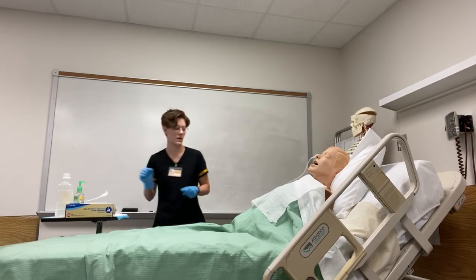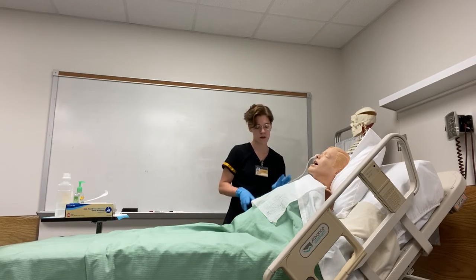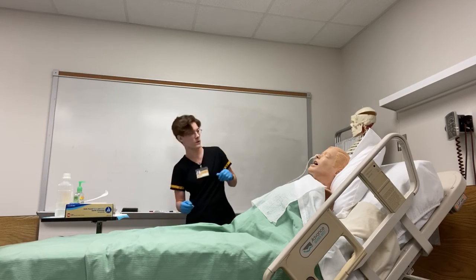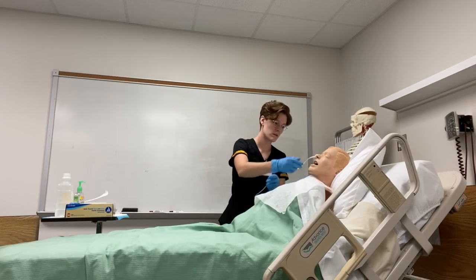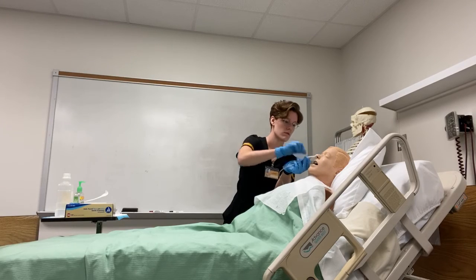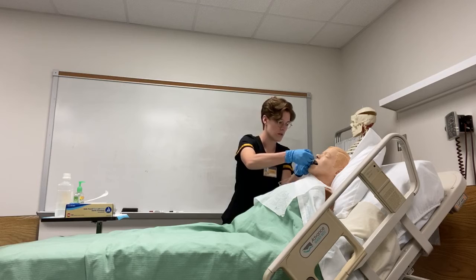So first thing, I'm just going to check with my patient, and can you please state your name and date of birth for me? Amanda Deer, 4799. All right, so the name and date of birth matches with my EMR. My order matches to discontinue the tube. So now I'm going to take the tube out of the patient. So you might feel a little bit of pressure with this, but it should be pretty easy and painless. Okay. So I'm just going to take the tape off. Great. Take the tube out.